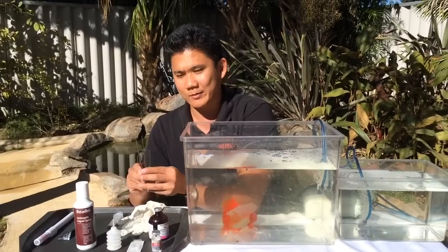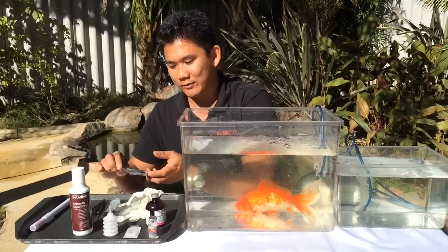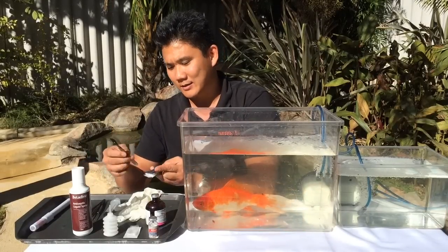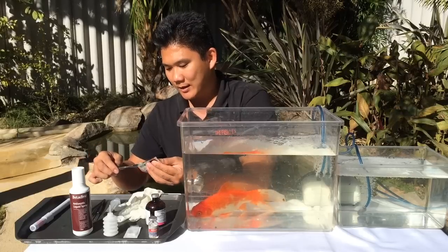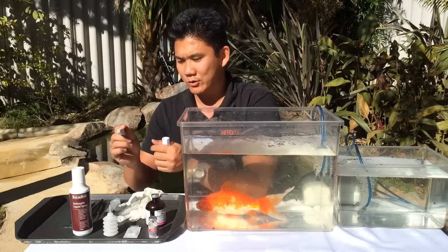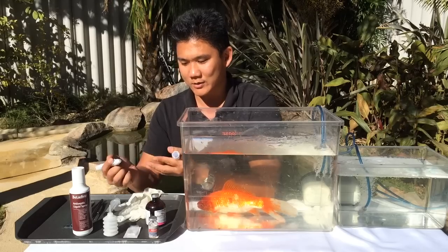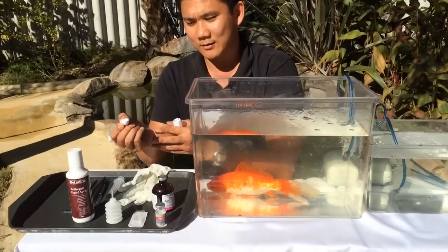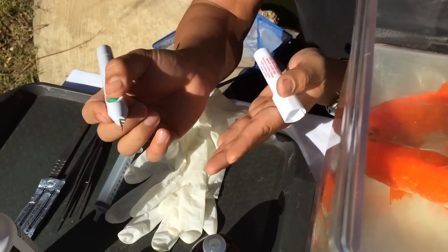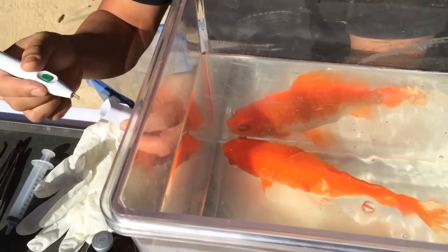I've got a couple of different types of forceps here depending on what I feel I need at the time, and to cut off the tumor we're just using a scalpel blade. The last thing we also have is an electrocautery unit — it's battery powered, it works really well, and if you just turn that on you can actually sear off all the additional bits of tumor that you may not remove fully using the scalpel blade.